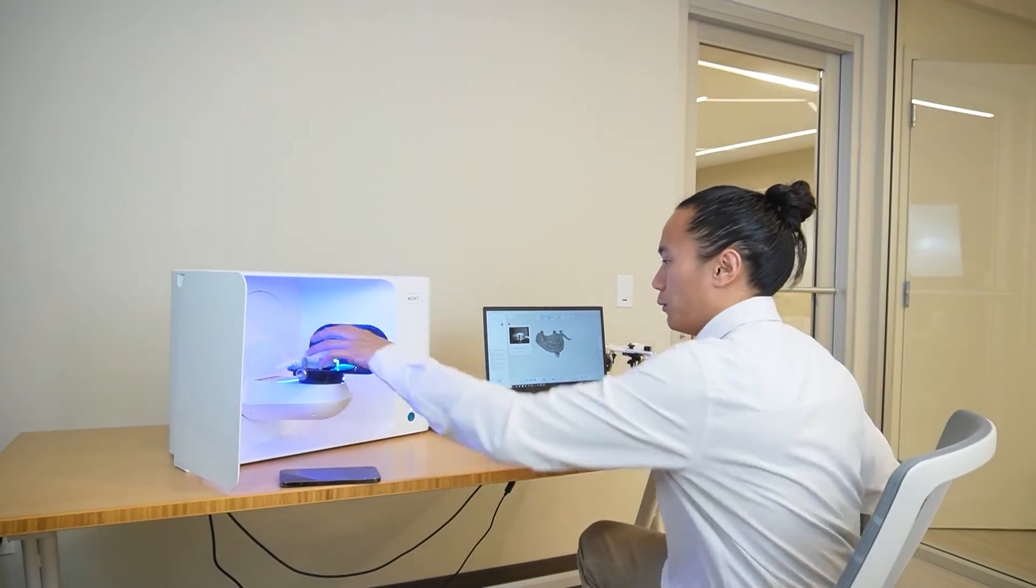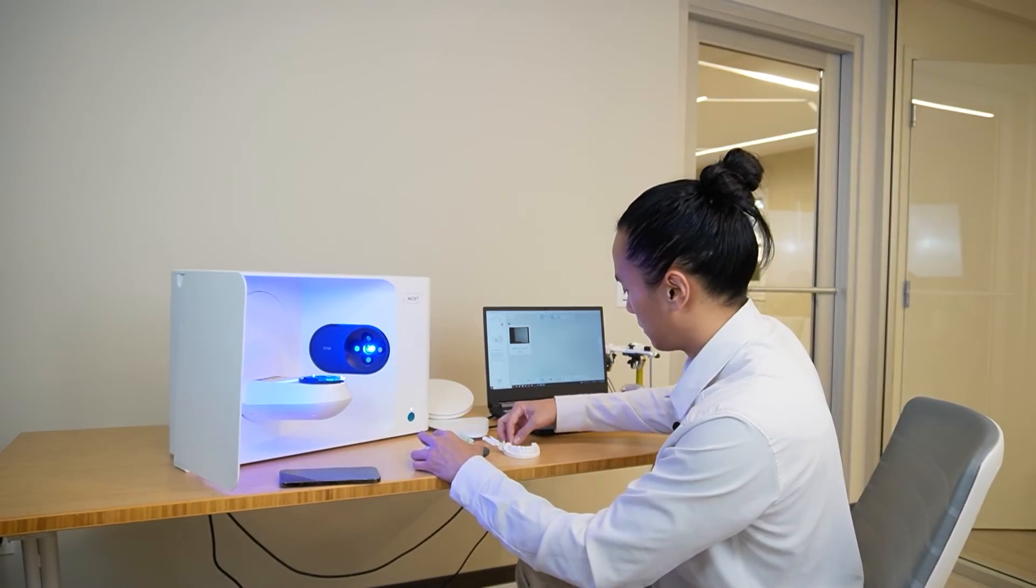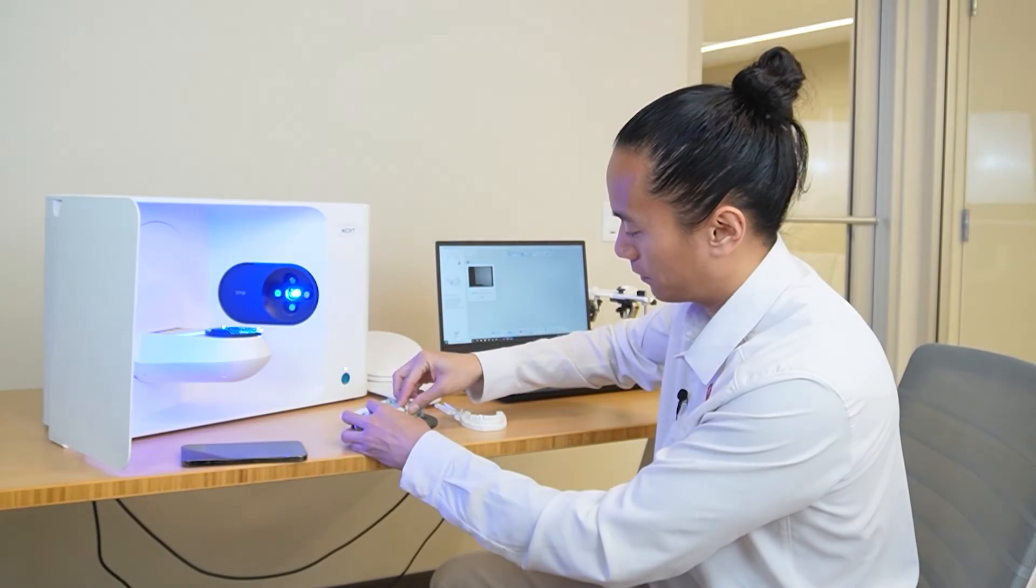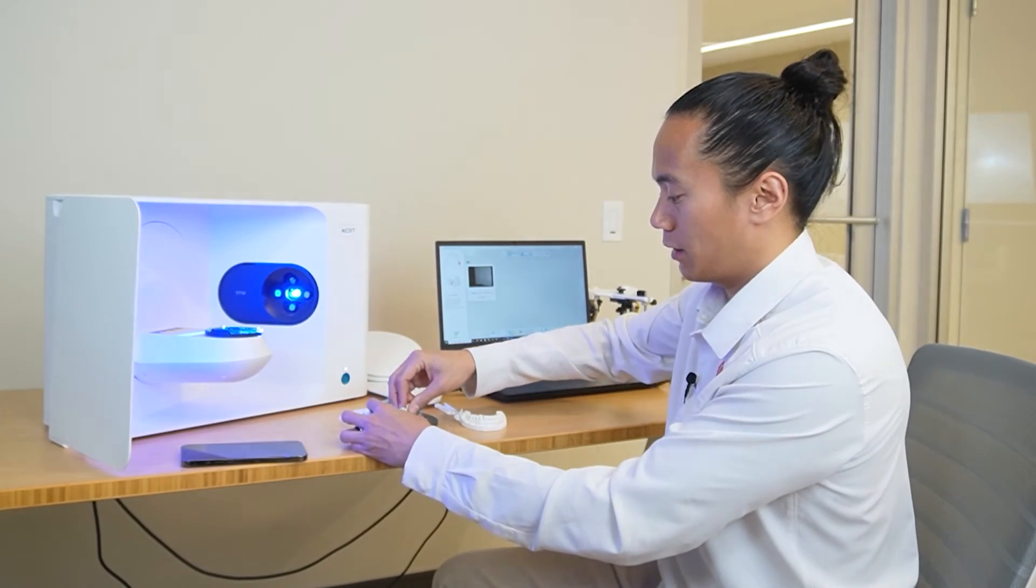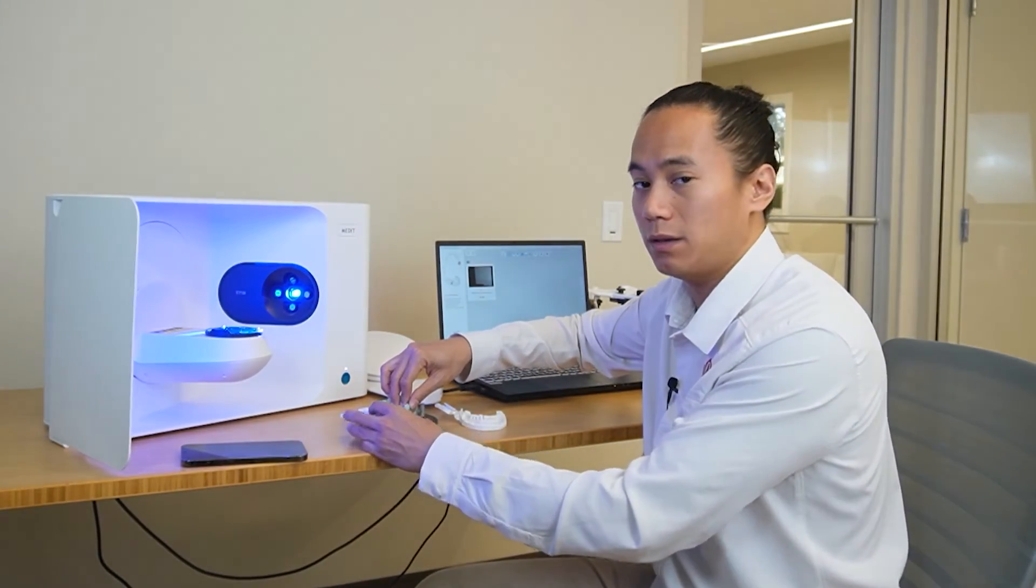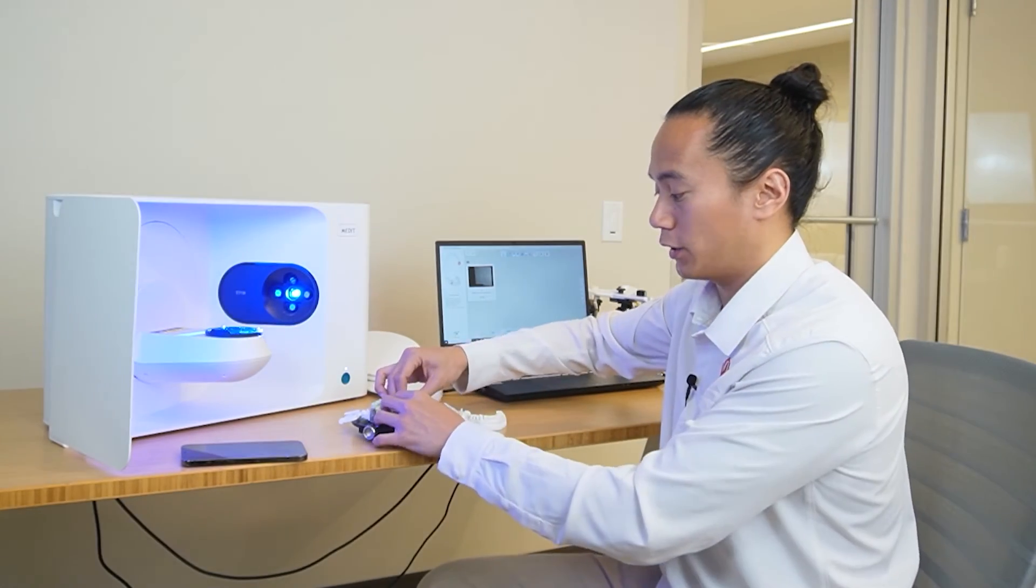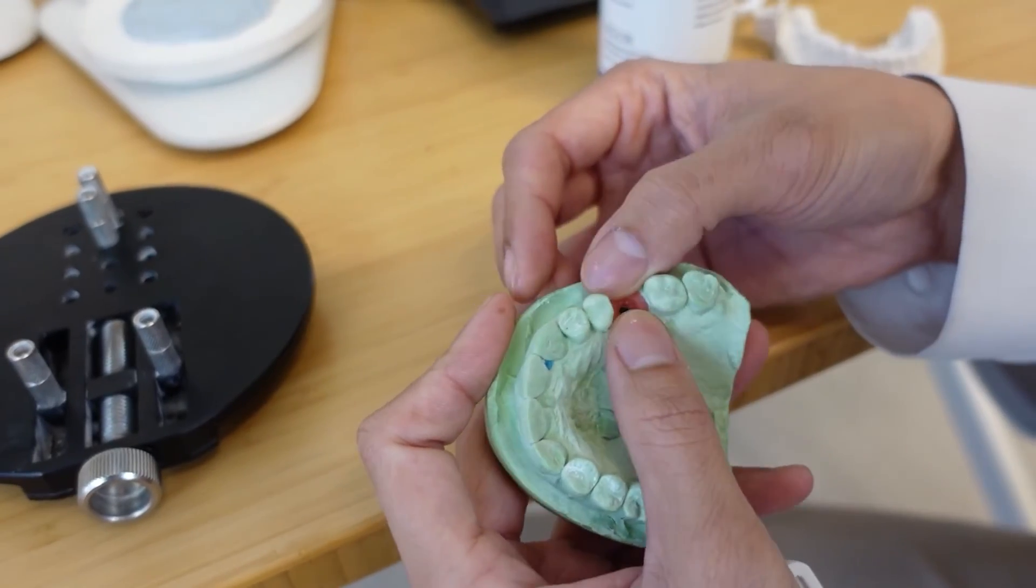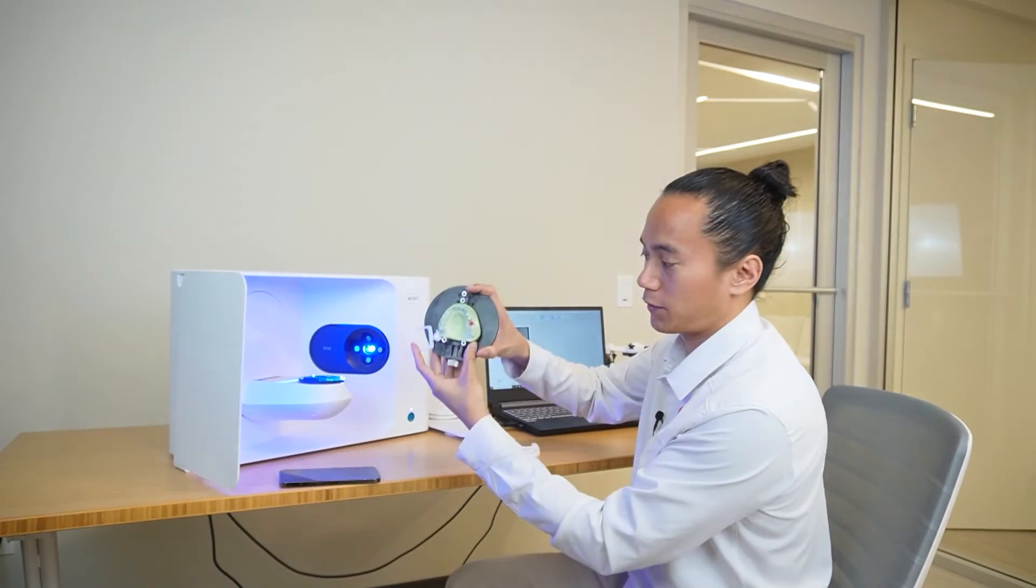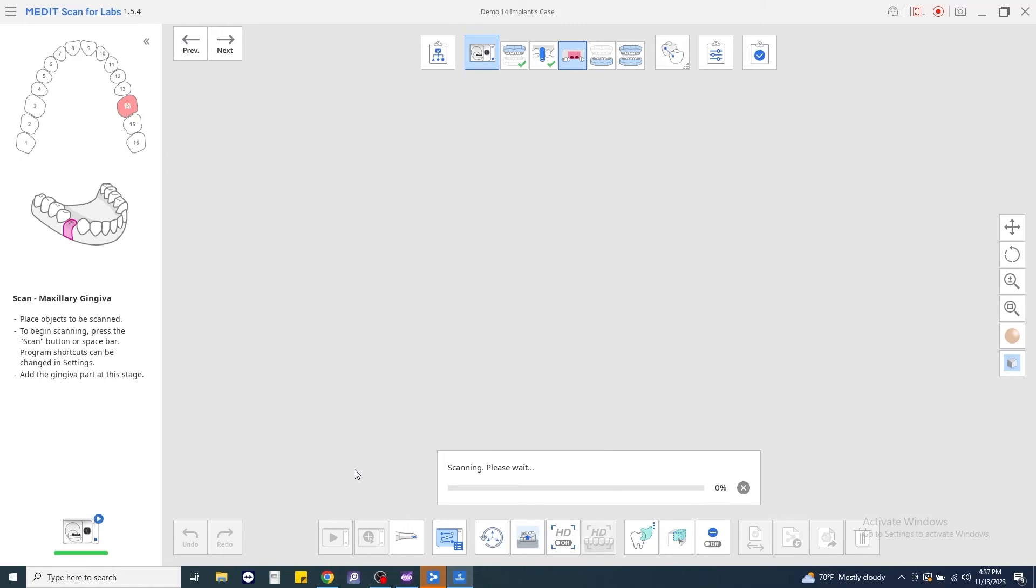Once we're done scanning, we'll go ahead and remove our stage. When we scan in the gingival, we want to make sure we remove the scan body and place the gingival mask back on. Now, you'll want to confirm that your original scan of just the model base did not have both the scan body or the gingival on it, or you're going to lose that data when it converts and aligns everything together. So, our gingiva is firmly seated in our model. We'll go ahead and place this back into our scanner and proceed with scanning.